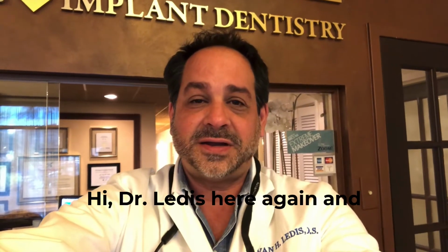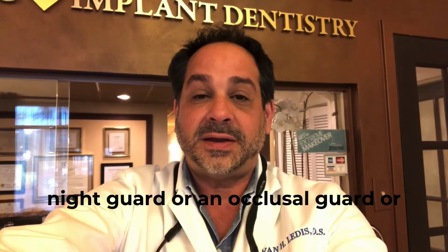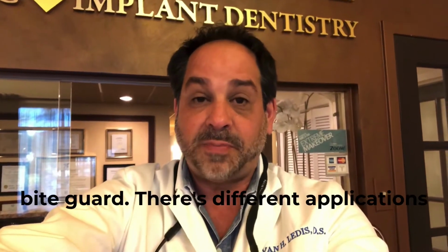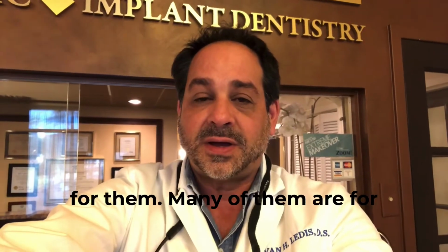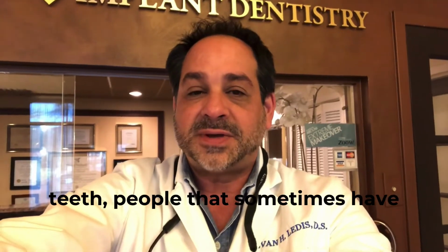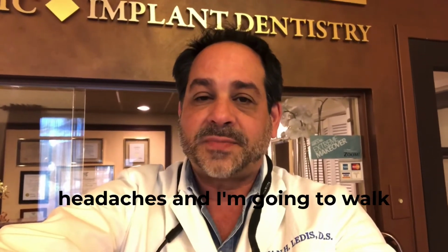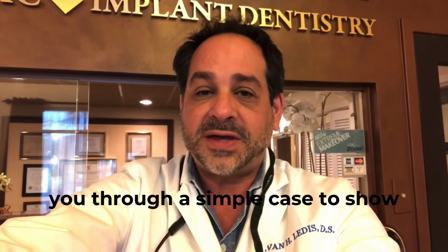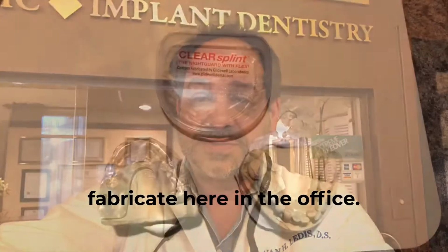Dr. Ledis here again, and I wanted to show you another interesting case that we come across quite frequently where we fabricate a night guard, or occlusal guard, or bite guard. There are different applications for them. Many of them are for people that clench and grind their teeth, people that sometimes have TMJ problems, popping, clicking, or headaches. And I'm going to walk you through a simple case to show you an occlusal guard that we fabricate here in the office.